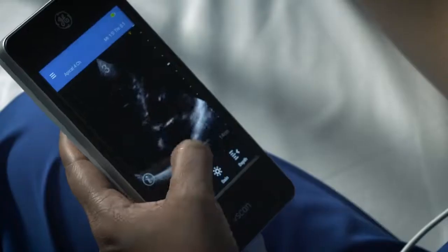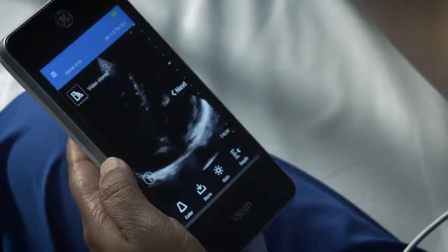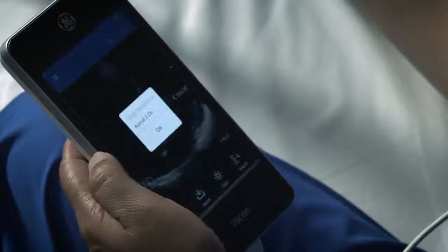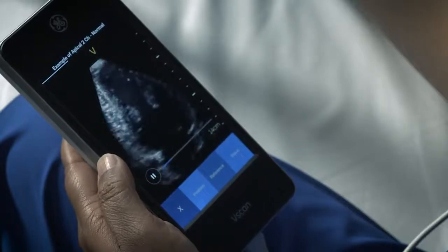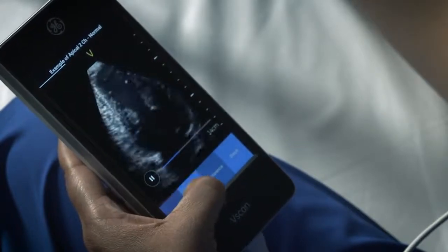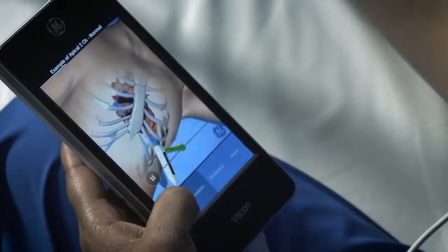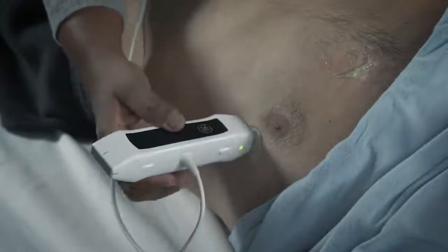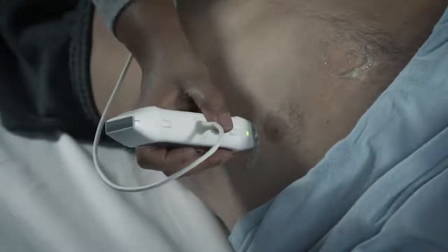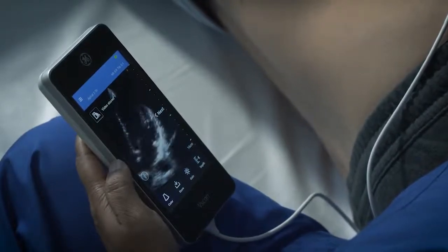You can continue with scanning and storing images for the active step. Once you have stored an image, swipe left to switch to the next scan plane. The Scan Coach reference information discussed earlier can be accessed by tapping the information symbol anytime during the exam. Continue scanning until all the steps are completed and the desired images are achieved.